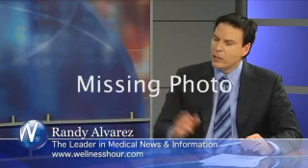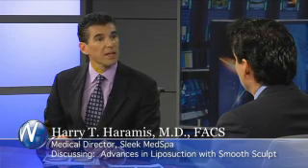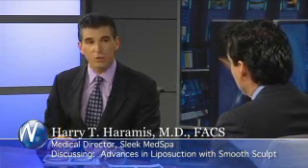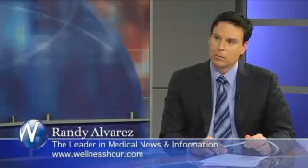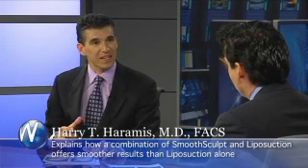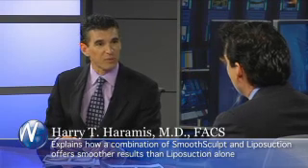So how do you do it? I mean, how do you go in with the neck? Little tiny incision under the chin or behind the ears. Again, the same technique, wetting solution, same protocol. We all do the same philosophy, same approach. Melt the fat, tighten the skin at the same time. Use very small liposuction cannulas, take out the fat. And you usually get more skin tightening than actual fat removal. So a lot of skin tightening.